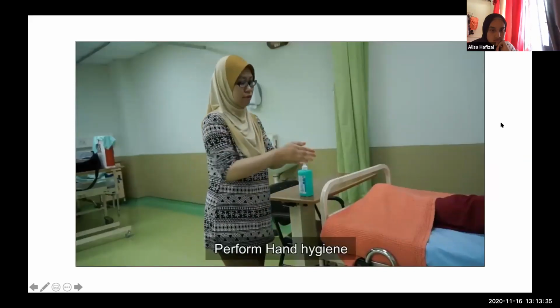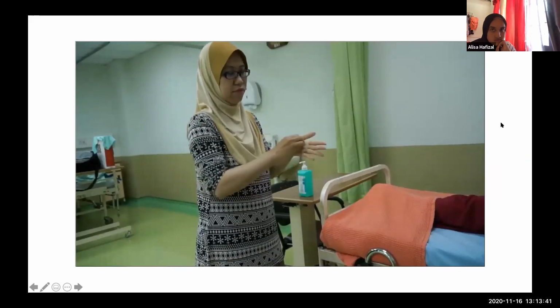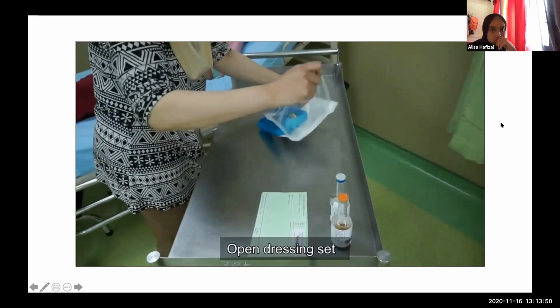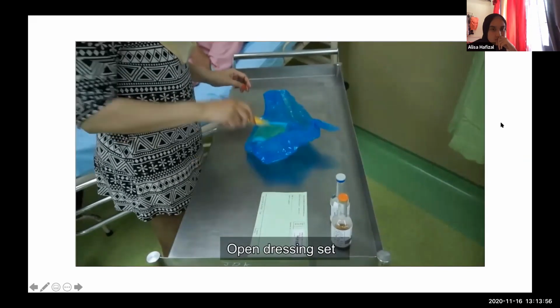Perform hand hygiene. Prepare blood collection set for 0.5% chlorhexidine gluconate in 70% isopropyl alcohol. First, open the dressing set.